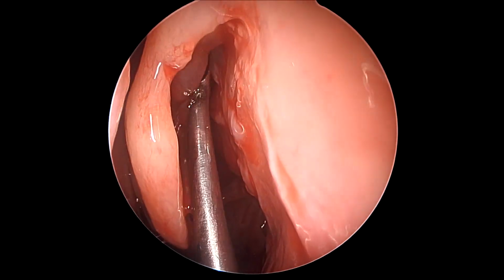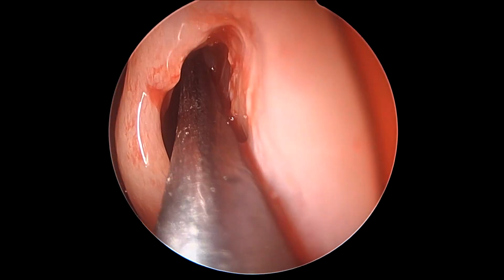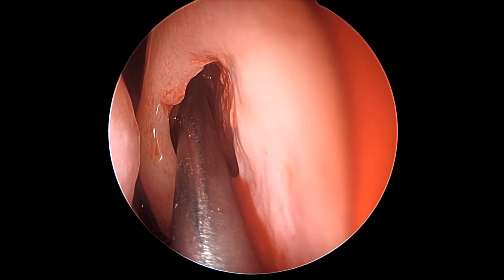Now we resort to a frontal sinus curette to clear more bone anteriorly, to fracture the posterior wall of the agger nasi as well, and to clear any remnant cells in the frontal recess that still occlude our access.